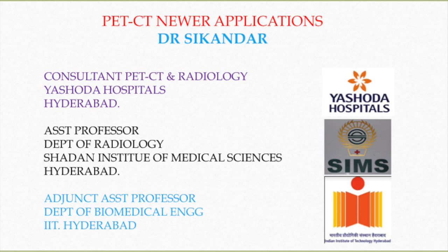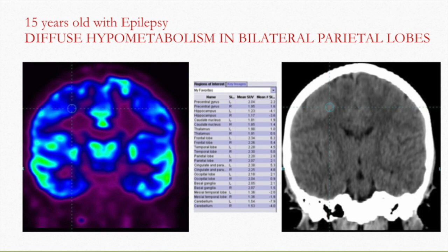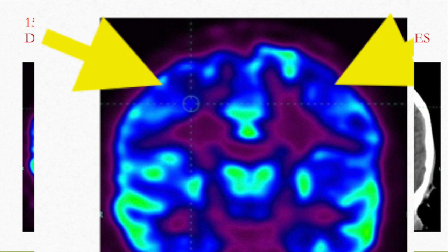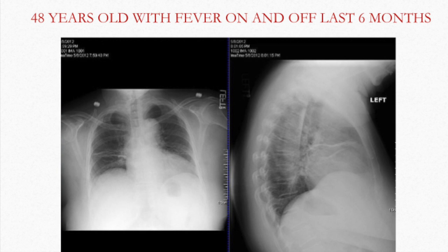I will now be showing newer applications of PET-CT. This is a 15-year-old with epilepsy. The PET was advised and it shows diffuse hypometabolism in bilateral parietal lobes, especially in the cortical and subcortical deep white matter, giving the indication of an epileptogenic focus.